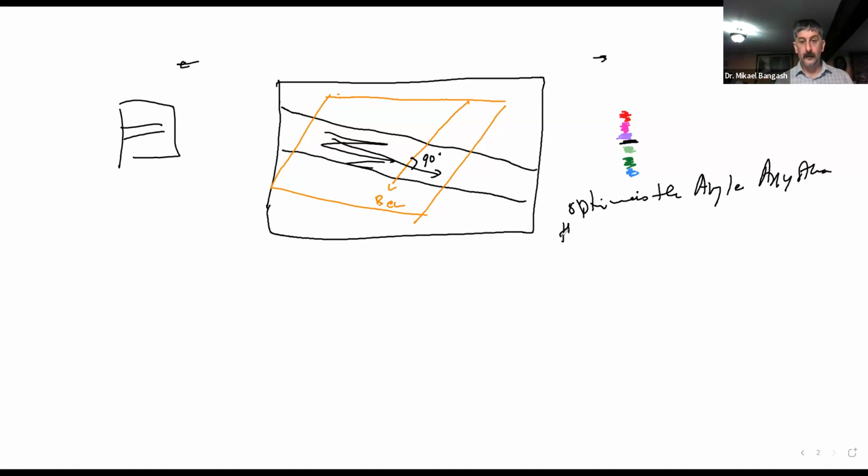Any other than 90 degrees, between our beam and the direction of the blood flow. Did you get that? So how do we do that?